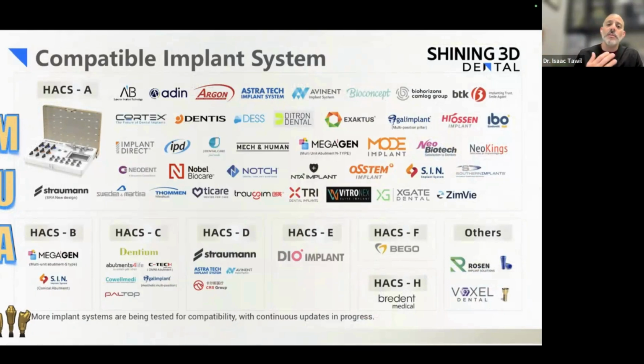And it does get a little confusing because Straumann is on both sides. They have an A kit. They also have a D kit. They were compatible with both. So you have to know which multi-unit you're using. So it's important to make sure you have that one. Make sure they identify it. Hopefully they have a label of what their multi-unit is before they send over a case. But you want to know which one it is, and you want to know which scan body they're converting to, to make it easy for your system.